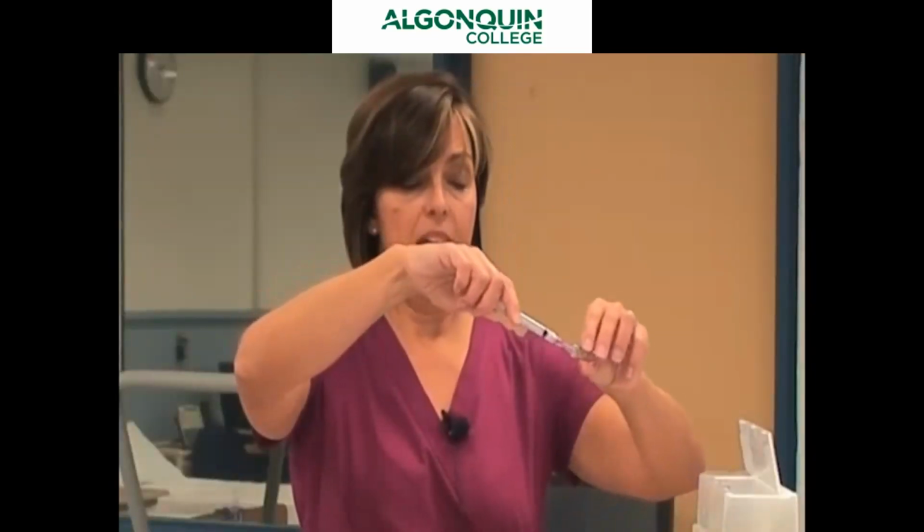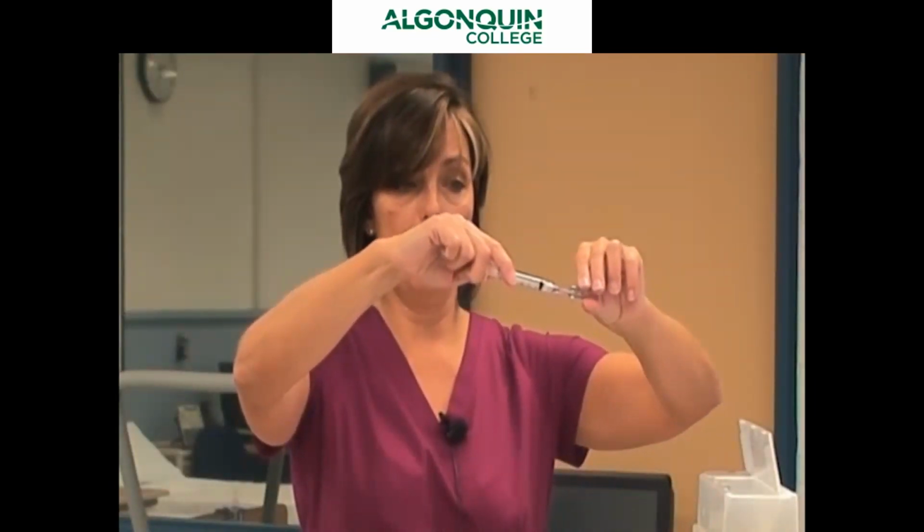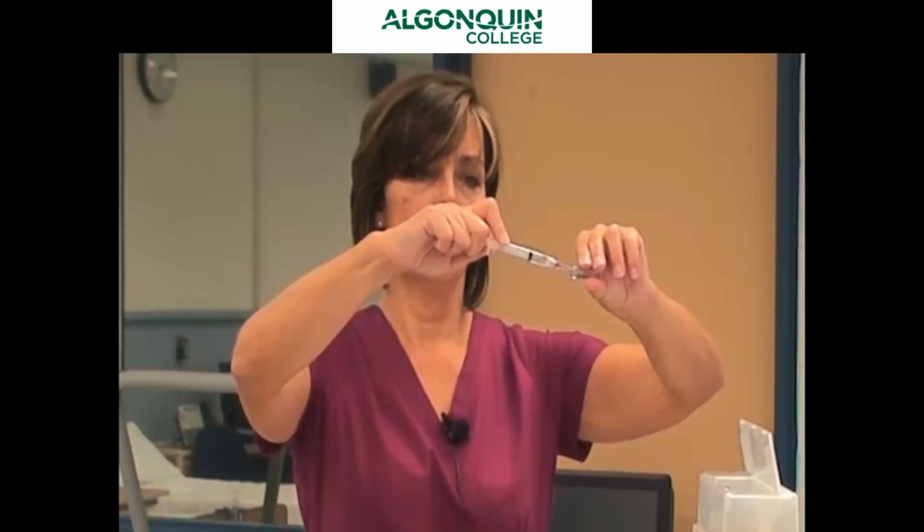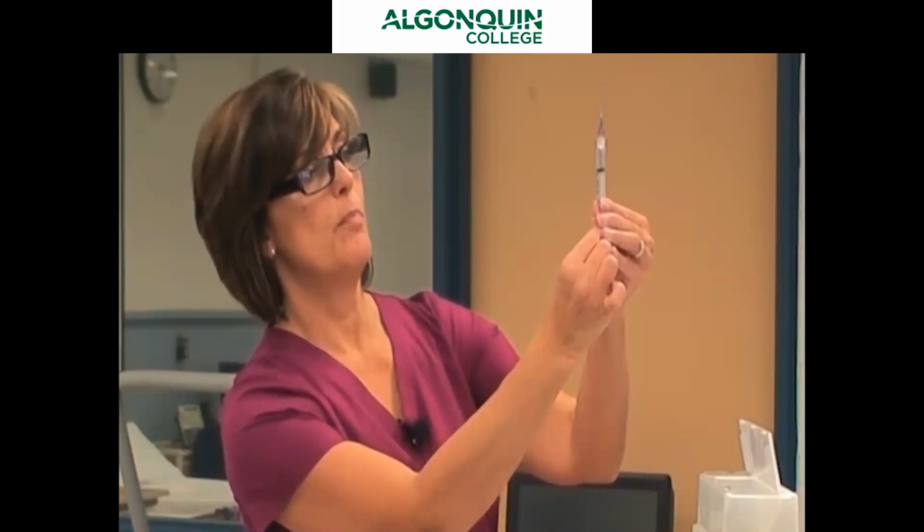I'm going to put my needle into my ampule, and I can then begin to draw up my medication. I'm going to draw up half a mil. I have just a little bit over half a mil of medication in here. I'm going to put my glasses on so that I can see exactly how much. What I like to do is pull the plunger down just a little bit to make sure that I have exactly 1/2 mil, and so that there is no medication in the neck of that needle.